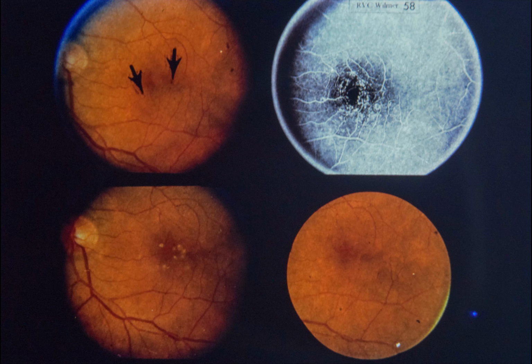Slide 58. Argon laser photocoagulation for retinal telangiectasis. This 49-year-old white male, also shown in slide 52, had 20/40 vision left eye. Upper left, note multiple microaneurysms surrounding fovea. These dilated vascular segments are better appreciated on the angiogram upper right. Lower left is a photograph taken immediately following argon laser photocoagulation treatment, during which 100 micron diameter coagulations were directed to each microaneurysm visible on the fluorescein angiogram.